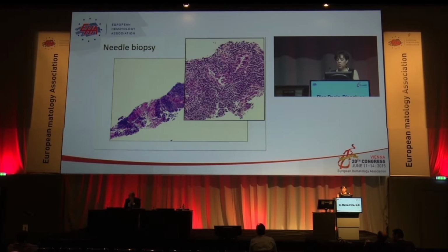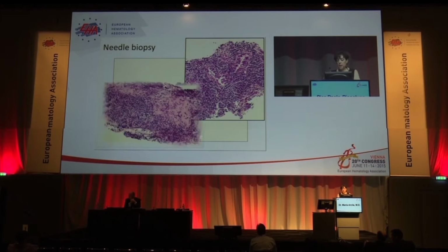So we decided to do both the testing that you would do for a non-small cell carcinoma, so we did EGFR, KRAS testing, but then we also did the LymphoTrack assay and the fragment analysis assay. But you can see here, this is a closer view of the lymphoid infiltrate, and this is the wedge resection of the same sample. Making a diagnosis of lymphoma and carcinoma in a needle biopsy is something that I myself as a pathologist wouldn't like to do.